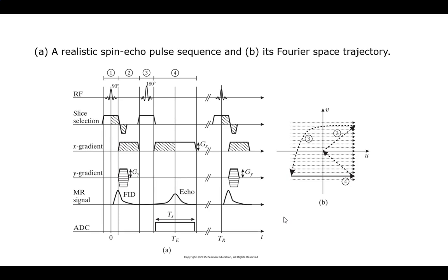Number one, when the Z gradient is active for the 180 tick, is there a reason that we don't go to negative Z gradient to balance it out, like we do the first tick? Yeah, that is a good question. For this one, we're really concerned that all of these here, this is our precision kick that gets everybody aligned. Right? This one, I'm literally upending the box. Right? Less worried about it.